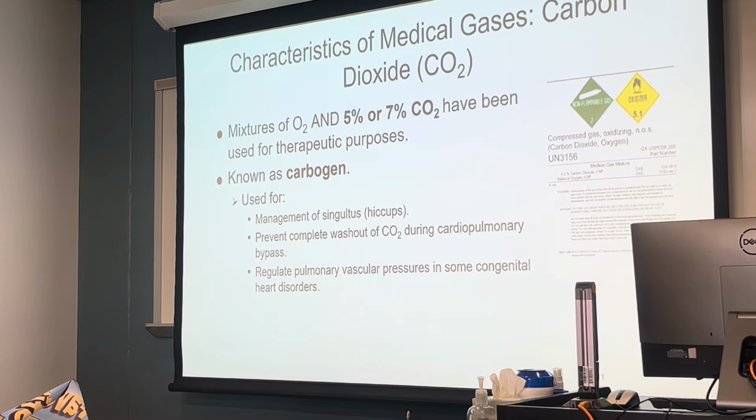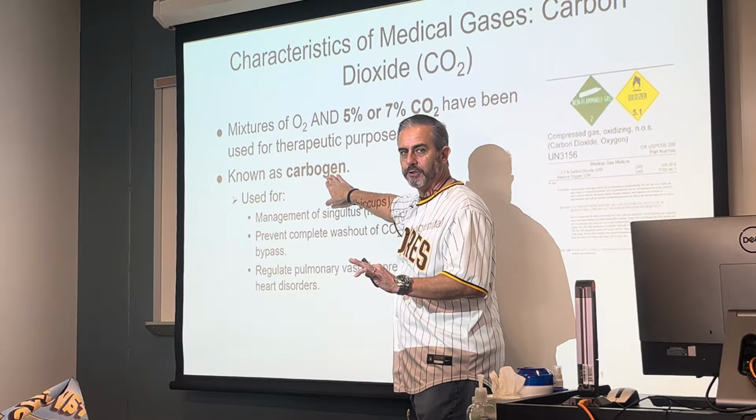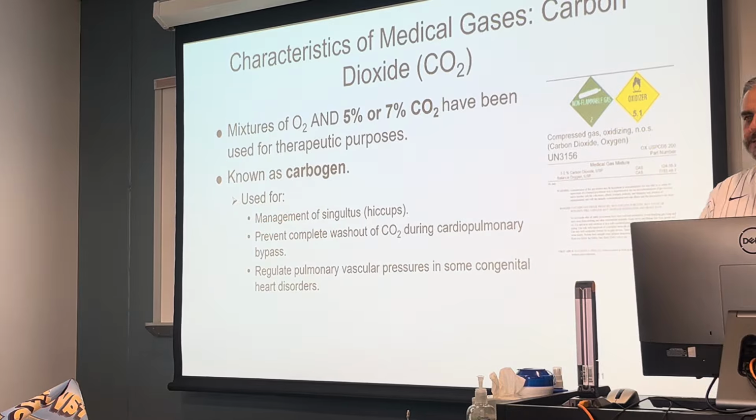you know what it's used for, right? So this is not the gas that we would use in a blood gas lab or in a pulmonary function lab. No, this is a gas we could use therapeutically to treat a patient. Management of singultus, the fancy word for hiccups.